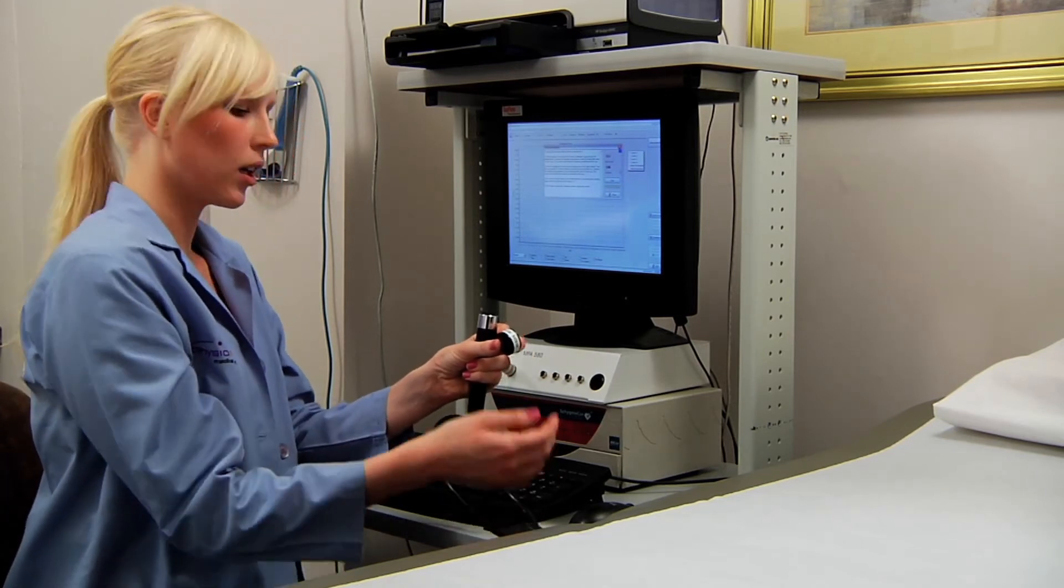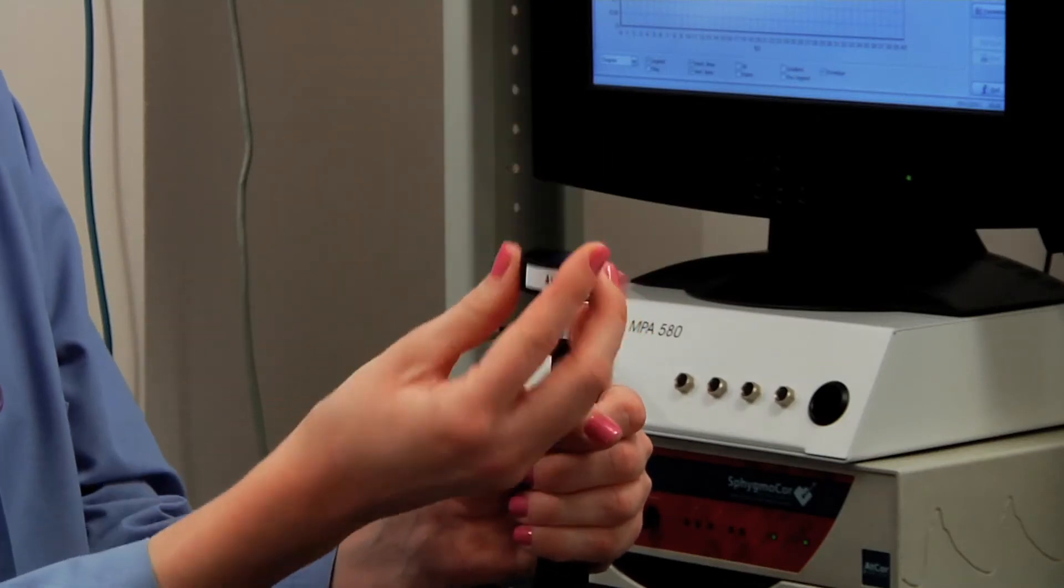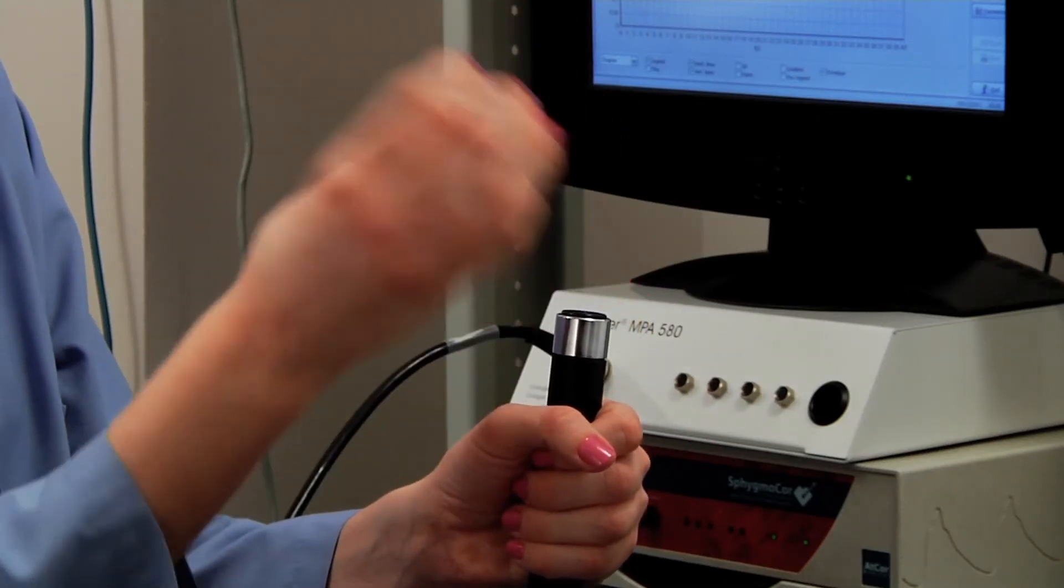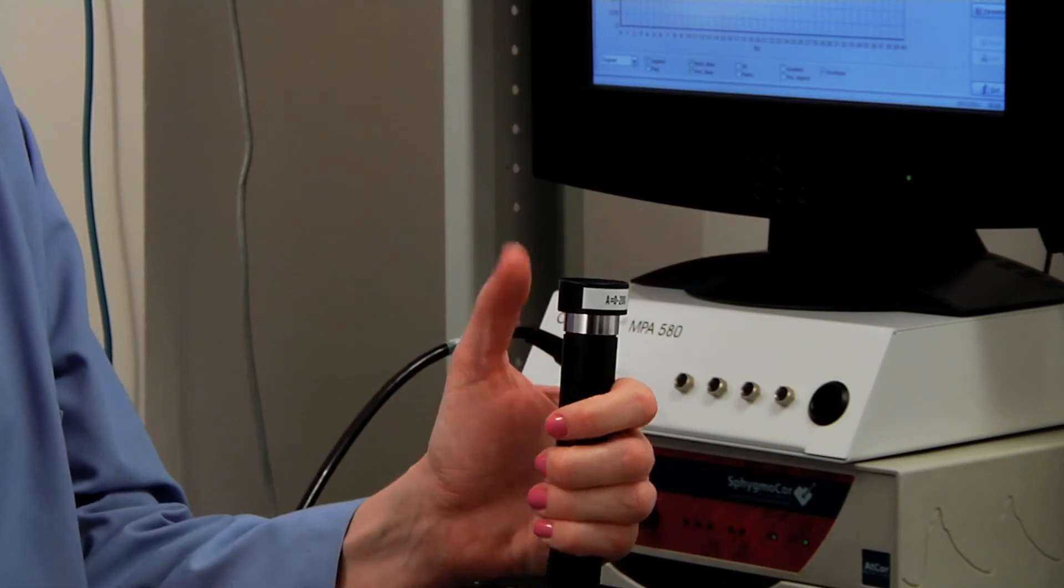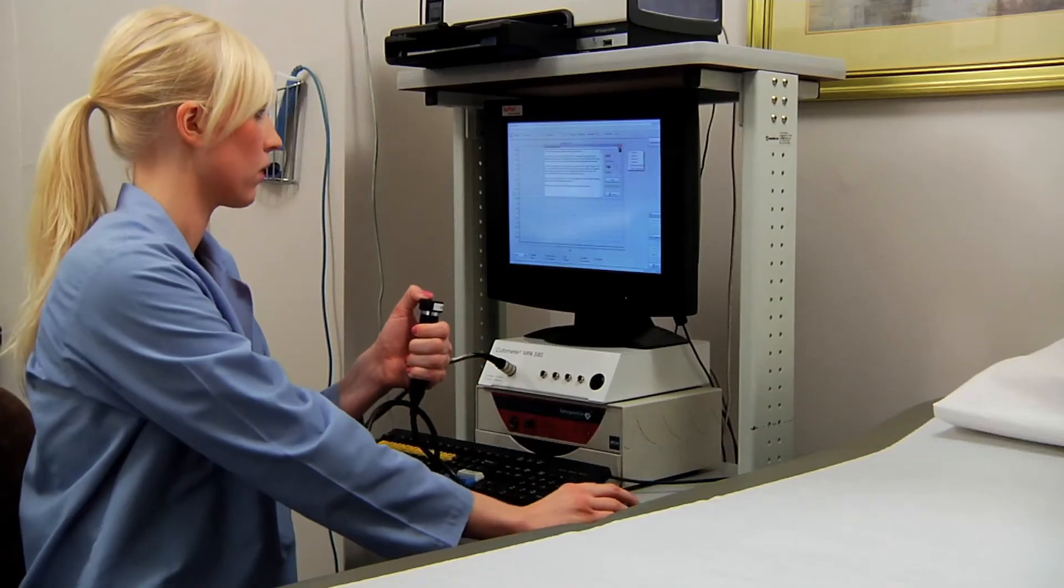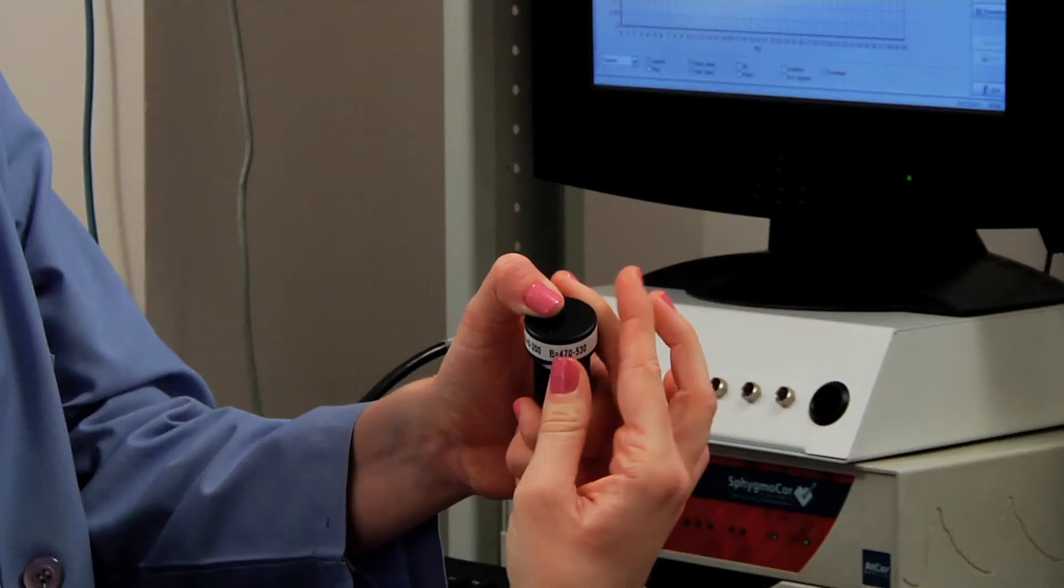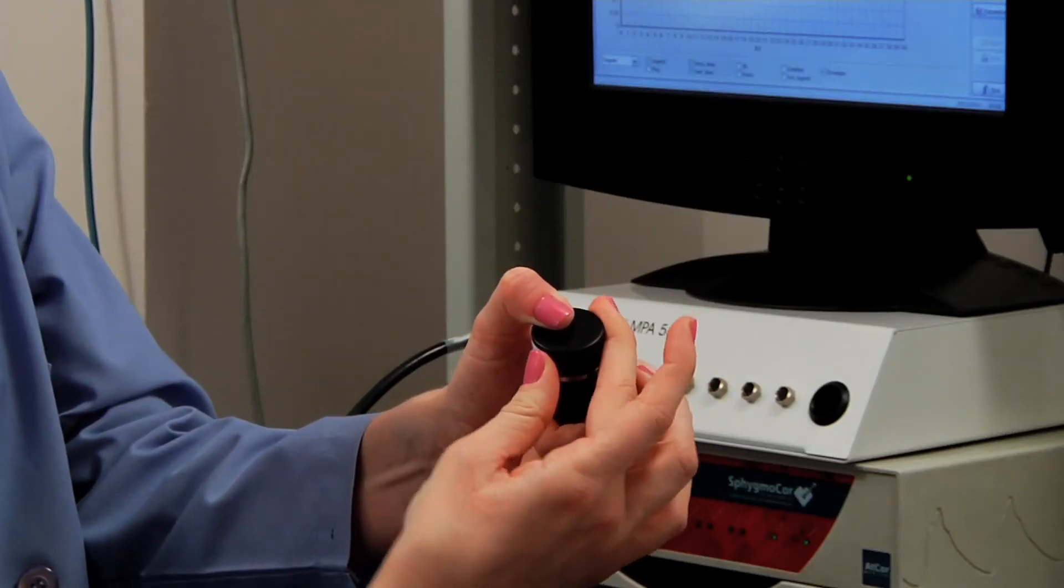For the second part of the calibration, you're going to put the cap tightly onto the probe. Instead of before you had it turned over, now you're going to actually put it on top of the probe. And you're going to push down, push the start button, turn the cap one full rotation while it's calibrating.